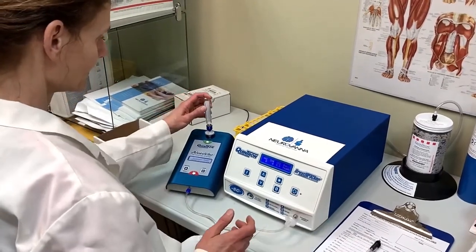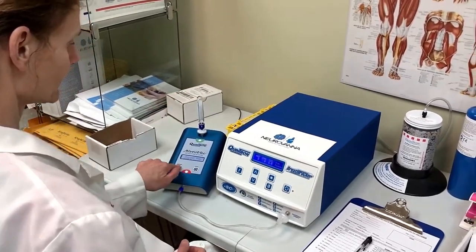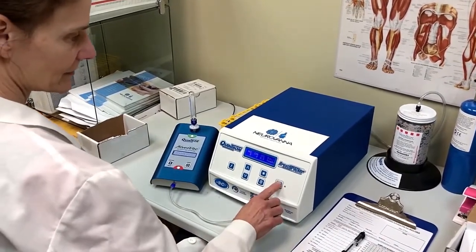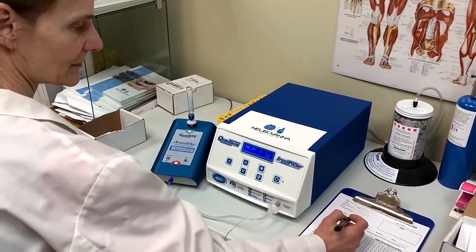Neurovana will process your lab and send results and interpretation to your ordering healthcare practitioner, typically in 2–3 business days.